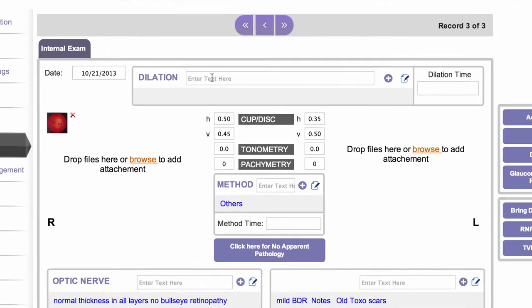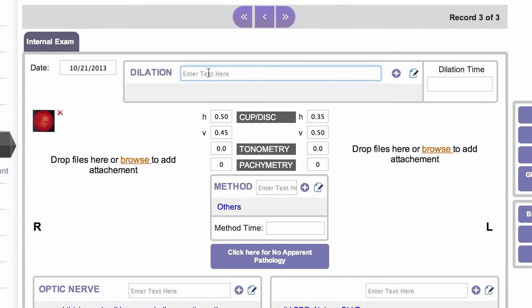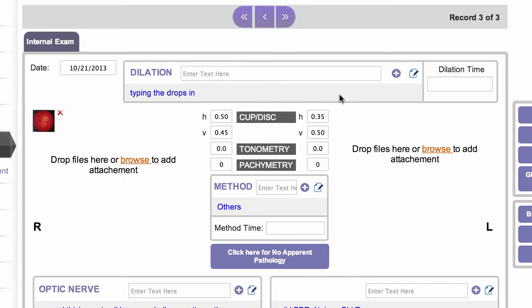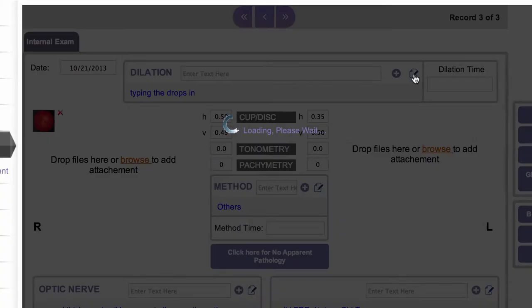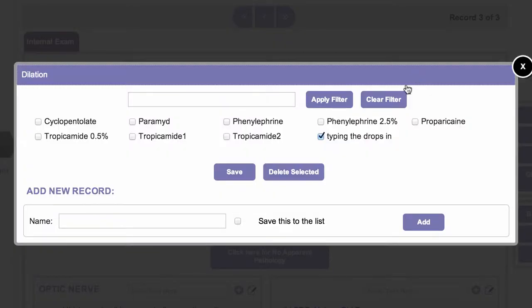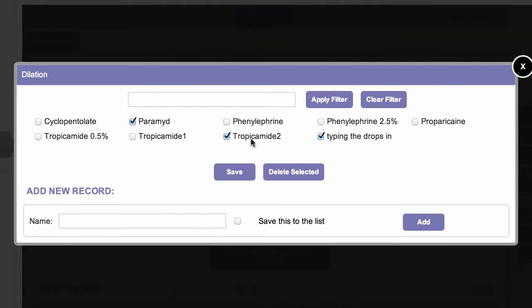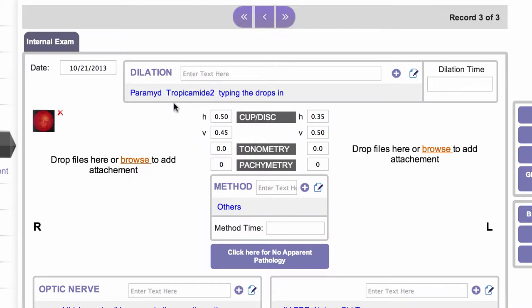We can record our dilation drops here and you can record them by typing. It drops in like that, adding it to the record. Or if you use the same drops repeatedly, you can create a short list of drops that you like to use, just click and save and it will record those drops. If there's something in there that you don't want, you can simply click the X to delete it.